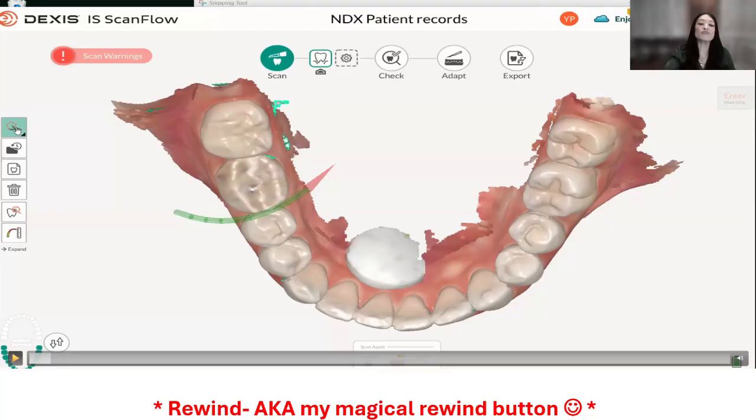But if we went ahead and erased that, we'd erase that anatomy and the patient's not there. So how do we get it back? Well, that's when the rewind tool really becomes valuable. As a matter of fact, I cannot wait for series 2, Kelly, when we show them how that can help us when we're collecting data for the margin and we just got one oops and we got to clean it up.